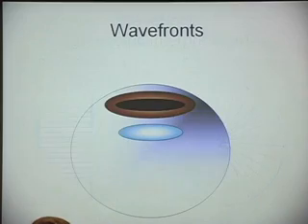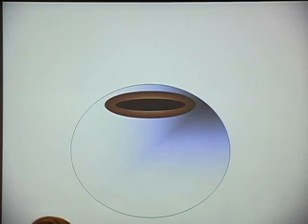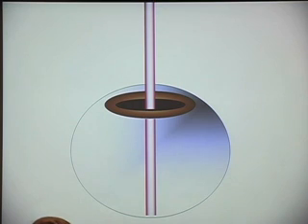That's a description. So we're going to take the eye. Rather than putting a light bulb in there, we're going to shine a small laser right down the top and make a bright spot in the back on the retina, just about where the fovea is, in fact. People get nervous when you're talking about shooting a laser into the retina, and rightly so. It's something you want to do carefully with as little power as you can manage, and the equipment that's out there all has a rating for how many seconds it's safe to put a person on there. We used infrared light so the person didn't see anything, but there's a thermal effect and it starts to warm up the retina. You don't want to keep them there for more than a few minutes. And in fact, we're able to do this all in a couple of seconds.